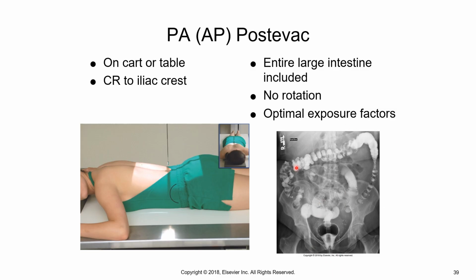And that's what you're looking for. Sometimes the radiologist might not like the fact that they didn't get rid of very much, and sometimes I've had them tell me to send the patient back into the restroom and tell them to continue emptying and come out after they've gotten rid of a little bit more.